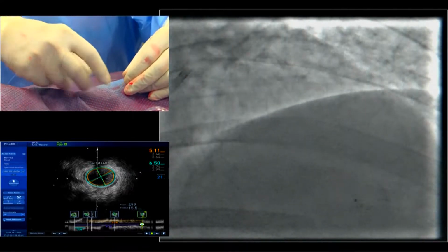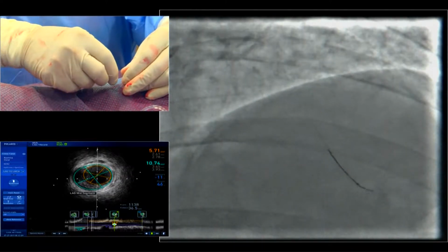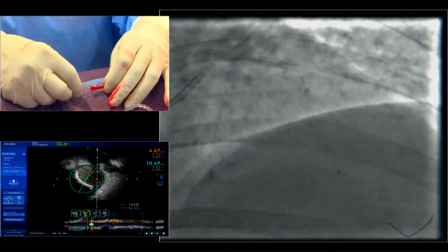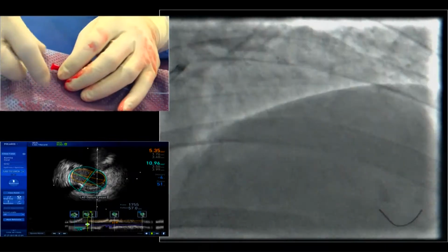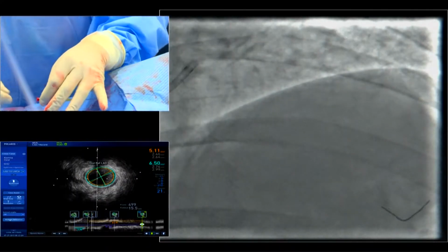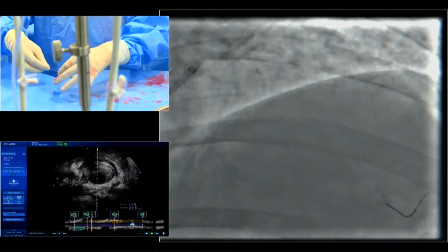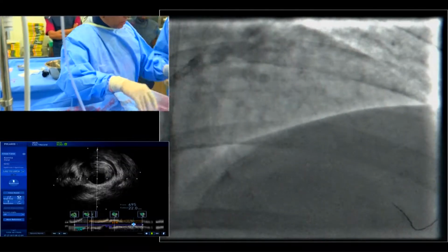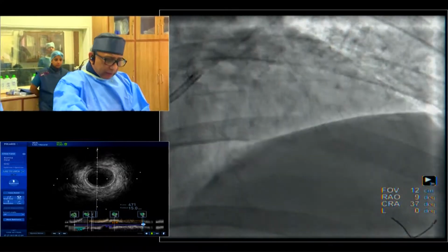Now the point is why I'm taking a 3.5. You see, now you are taking a microcatheter for exchanging on the micro. I am changing the 2 rota wire. Okay. Yeah, that's it. The plan is to take a 1.5 rota. So why am I taking a 3.5? Maybe 1.75. I'll take a 1.75 rota. Actually, this is a 7 French catheter, right? Yeah, that's it. 7 French catheter, right? Yes. Okay. Perfect.